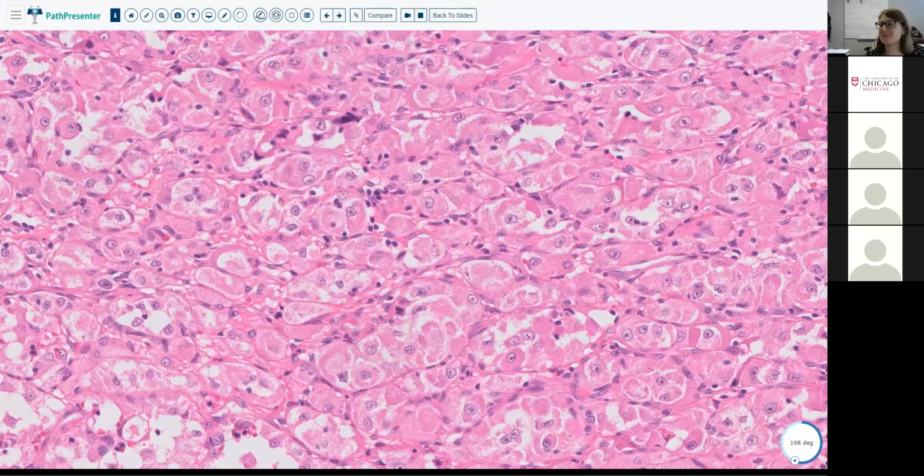This was a trick. The diagnosis isn't on here. Okay, so does anybody have any other votes for what this is now that you know the diagnosis is not on your poll? I wanted to call it a PEComa. Alveolar soft part sarcoma. Yes, so I think alveolar soft part sarcoma and PEComa are also excellent ones to put on the differential. This particularly is an alveolar soft part sarcoma.